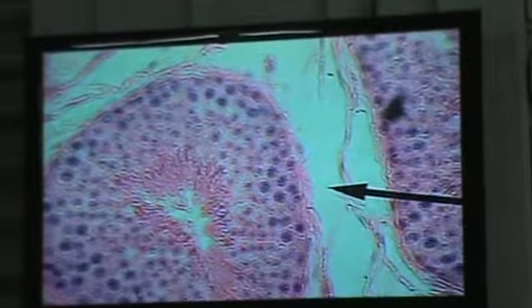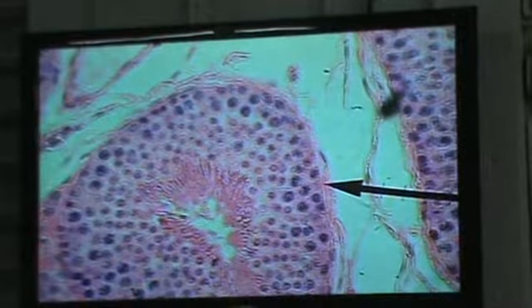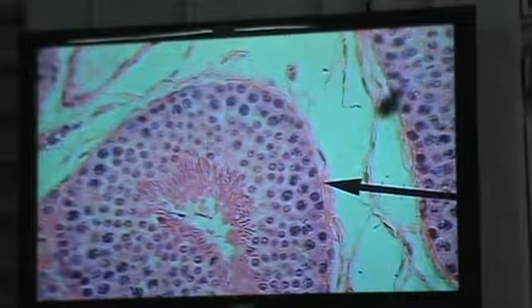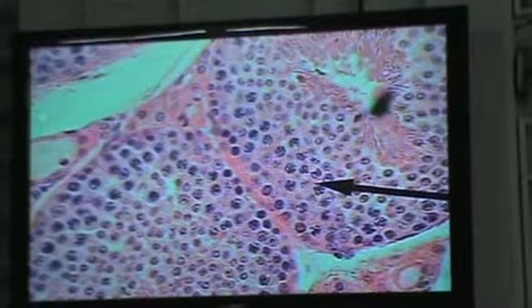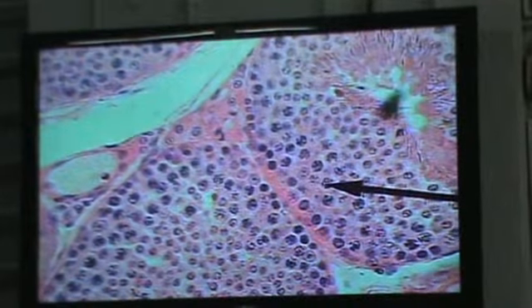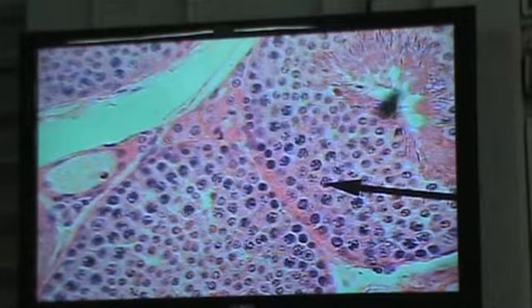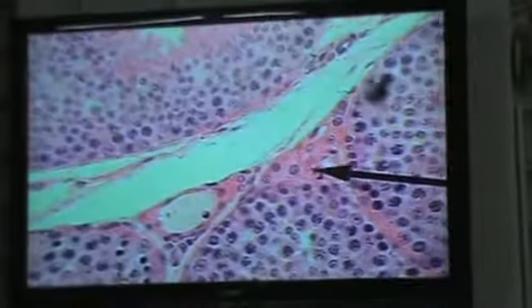So what's very apparent is the high level of mitotic activity, the meiosis and mitosis occurring, because we're seeing a lot of protein material, etc. You can see a lot of mitotic figures here. Okay, you can see that all. Look at that. So there's a lot of cell division going on. Okay, so you see all sorts of different things occurring there. You can see all the various divisions occurring.